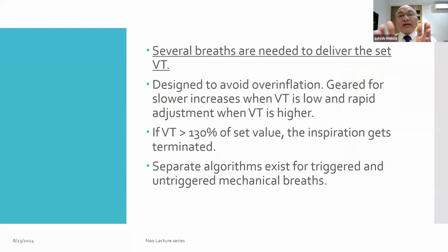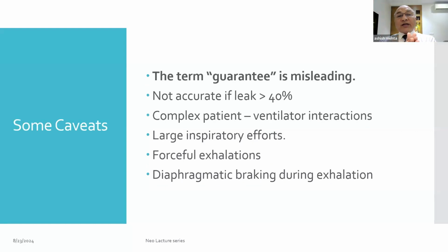The problem here is that it is not breath to breath. Several breaths are required to deliver the set tidal volume. Basically, it is designed to avoid overinflation. When the tidal volume is very high, for example, my spontaneous breath is really very good, I've woken up and I'm breathing, I have good, strong spontaneous effort, at that time, if the tidal volume is too much, the inspiration gets terminated. That is good about it. But as I told you, the term guarantee is misleading.